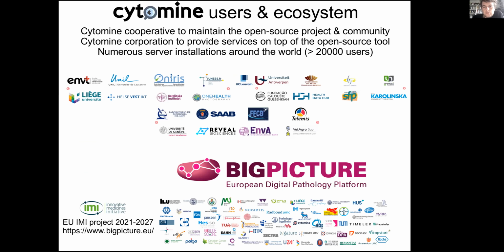If you are interested in using Cytomine, you will not be alone because we have more than 20,000 users over the world that are using Cytomine either in research or in education settings. In addition to my research lab at the university, there are 2 other entities that can help you. There is a Cytomine cooperative that provides basic support and maintains the open source project and community.